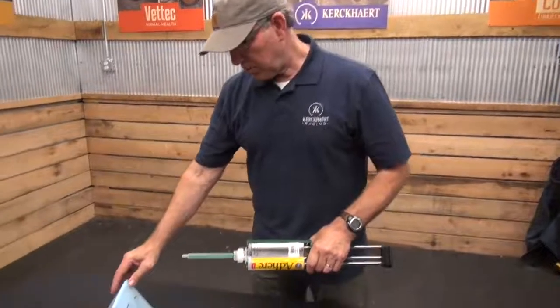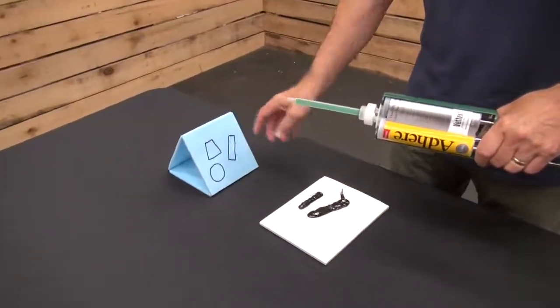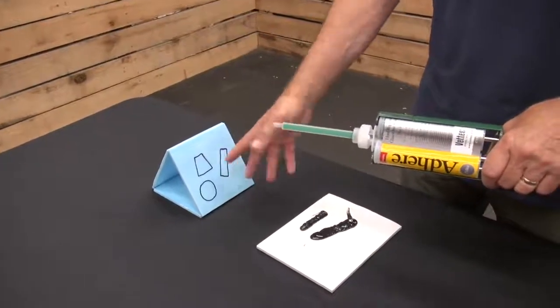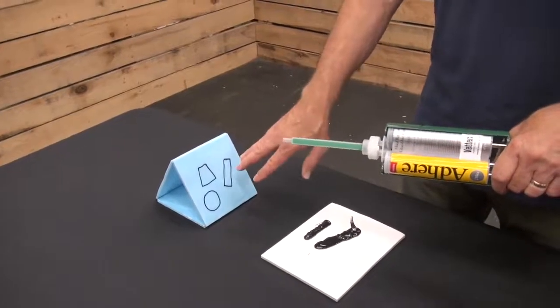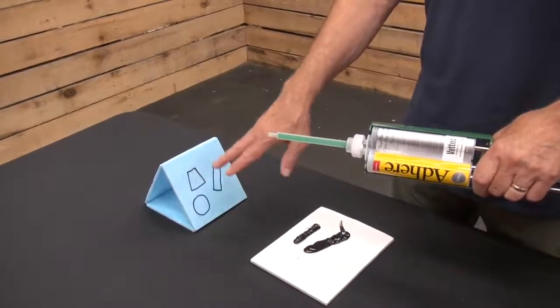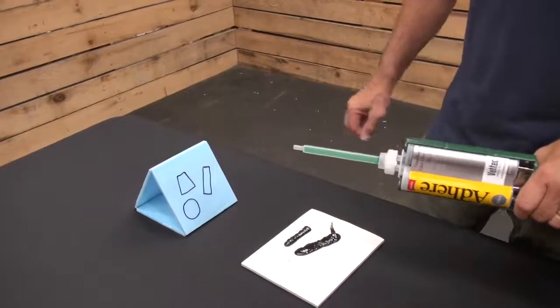So I'm going to show you a surface here that's fairly vertical, and I've just drawn some shapes on here. And of course, these aren't indicative of what we would see on a horse's foot, but my point is to show you how you can fill in these types of areas and with a lot of control simply by using a specific technique. So let's take a look at that.